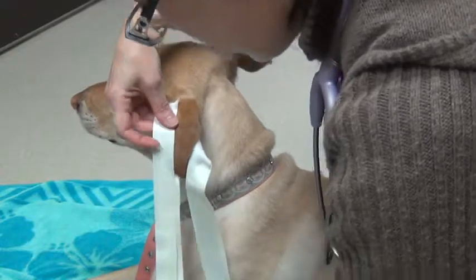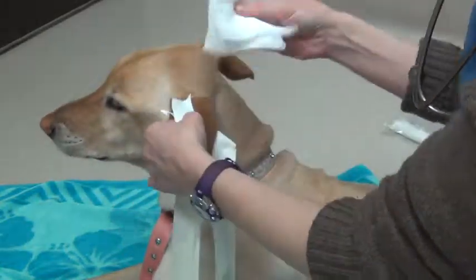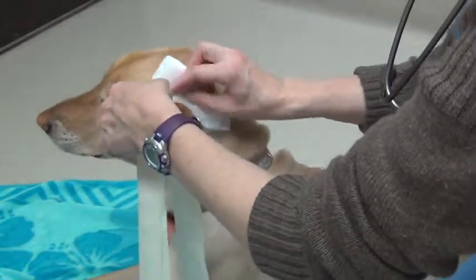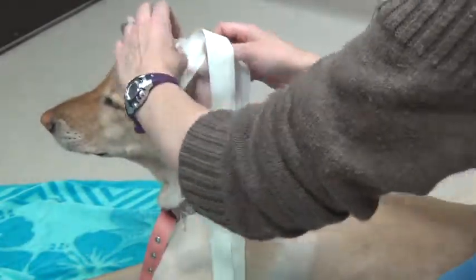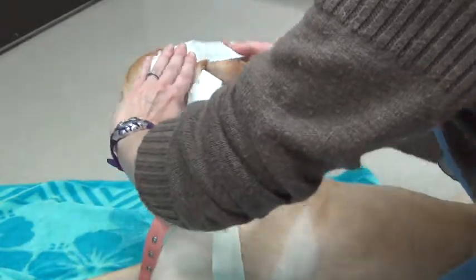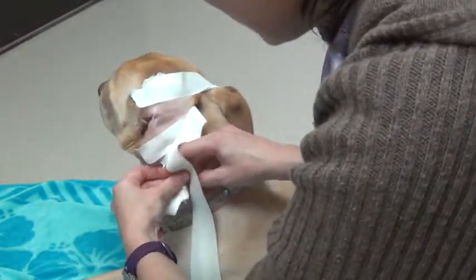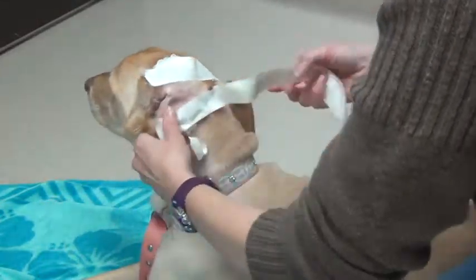A lot of weird stuff going on here. Okay. At this point we're going to go ahead and use our gauze and position that up on top of the head, right where we're going to roll the ear over on. So we're just opening up the ear, putting it up on the head. And we're going to go ahead and fashion the tape down. It looks really weird, but it works.